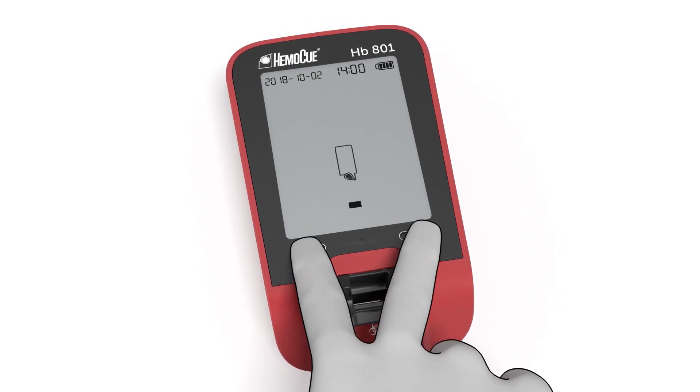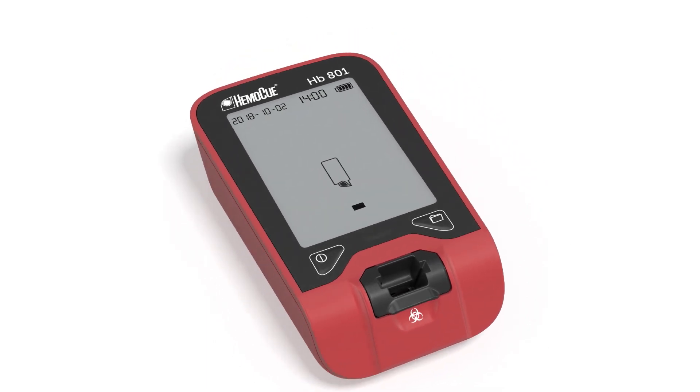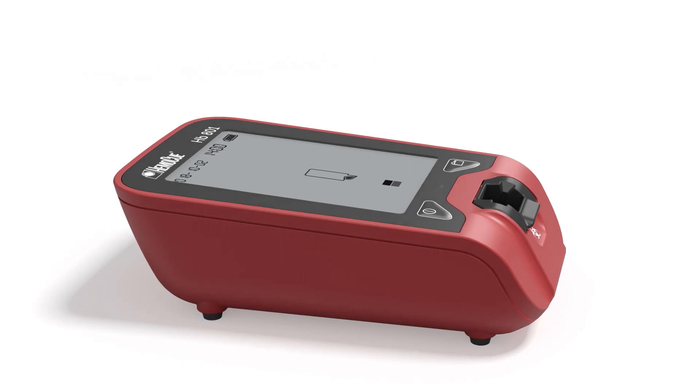Exit by pressing both buttons once. Your HB801 is now set up and ready for use. For more information, please visit HemoQ.com.